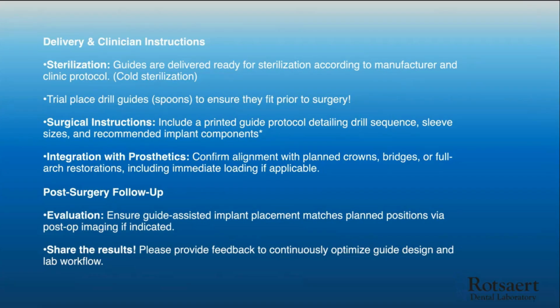Bear in mind, you want to try in those trial drills, the spoons, try the drill guides into those sleeves in the template. You don't want to find that out right away, day of surgery. Open up the kit, check them to make sure that when the patient comes in, everything's going to fit well. That's the last thing we want, is we find out after that you're unable to use it.